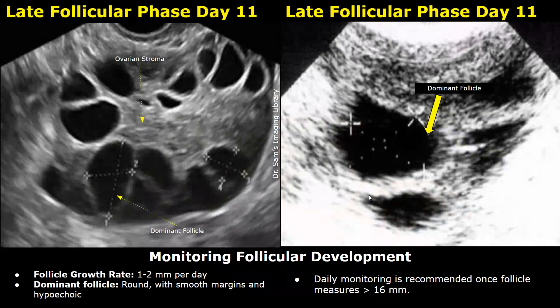These images are obtained on day eleven — now it is the late follicular phase, which spans from day eleven to thirteen or fourteen. The follicles further increase in size. In the left image, one follicle is the dominant one, and in the right image this is the dominant follicle. These images are taken from different patients.